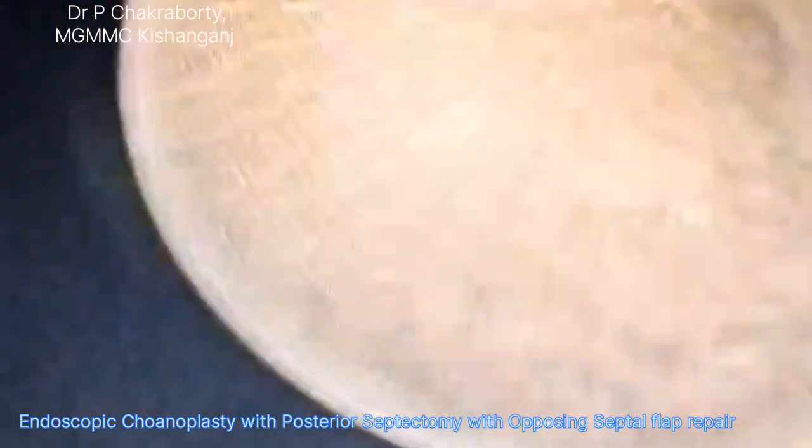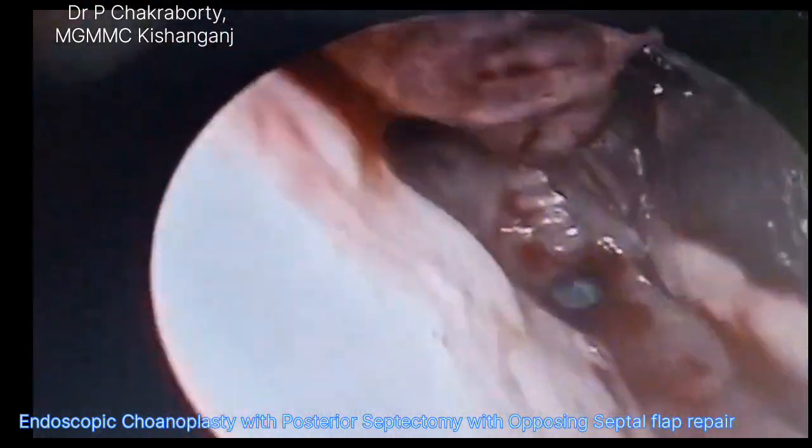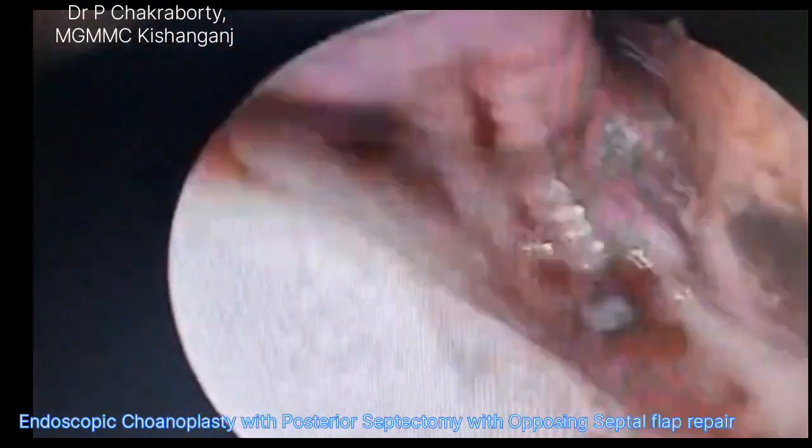From the left side and from the right side, both the sides, we make two flaps, one is inferiorly based and one is superiorly based, and we cross over the flap to the opposite side to cover the raw area.